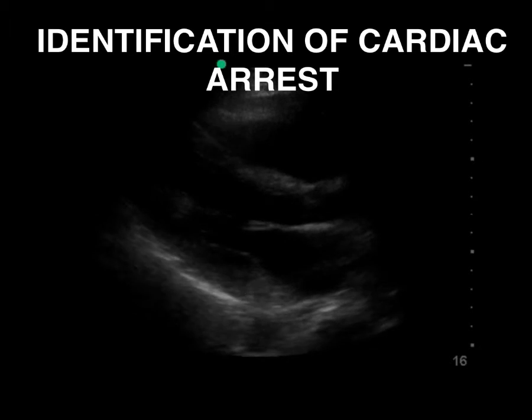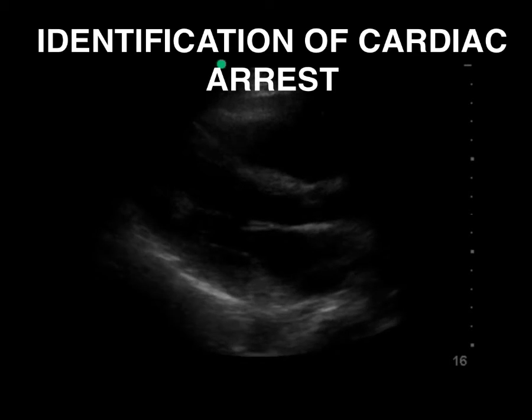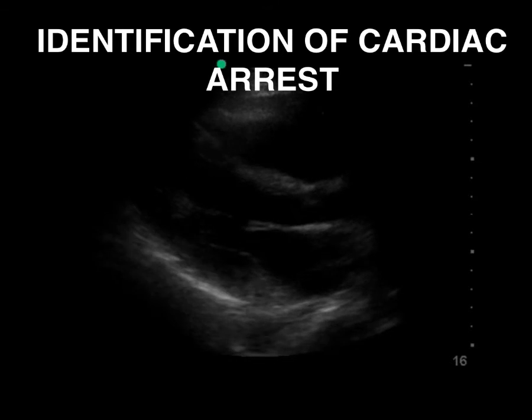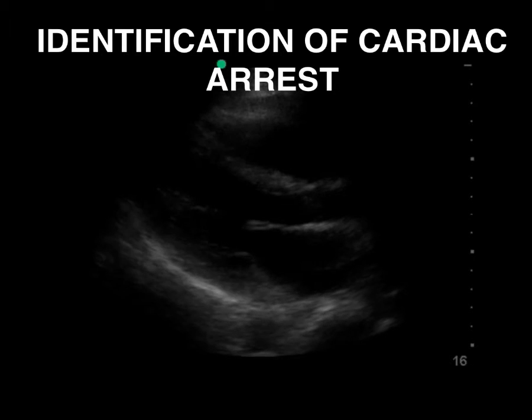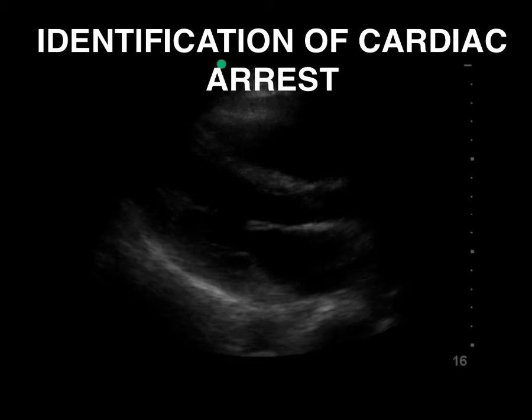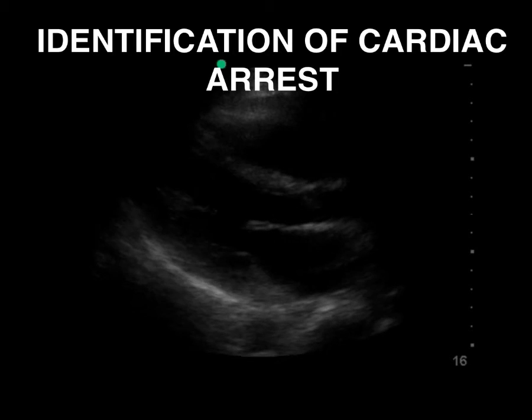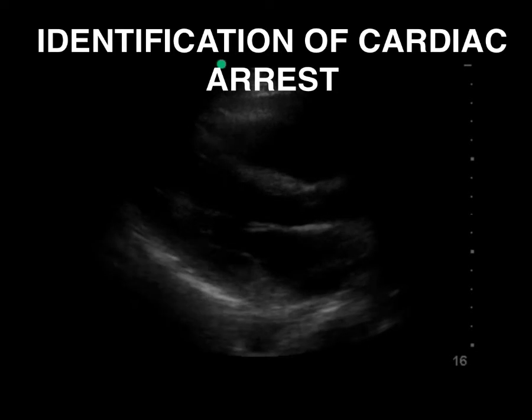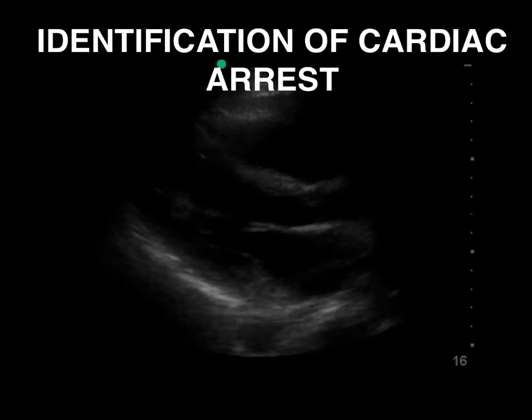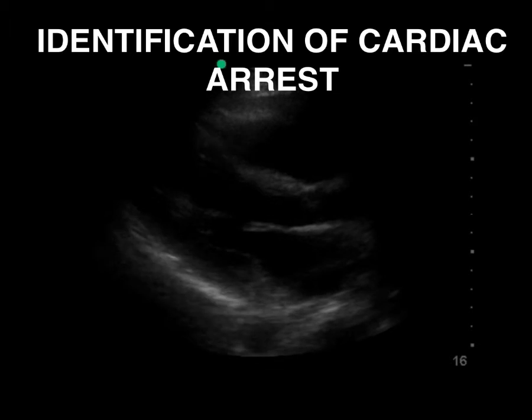So we continue looking for a pulse in this patient. How long do you think the search for the absence of pulse could have taken in this patient? It was definitely more than 10 seconds from when they activated the code until I arrived there and we did this point-of-care ultrasound. So you're probably thinking, well, they should have started CPR before, assuming they couldn't find a pulse. But in reality, sometimes providers simply don't know, and it takes some time to establish that point. So point-of-care ultrasound is much more sensitive and reliable to allow us to assess what's actually happening with the heart compared to a pulse check.